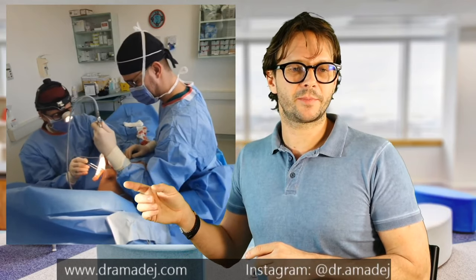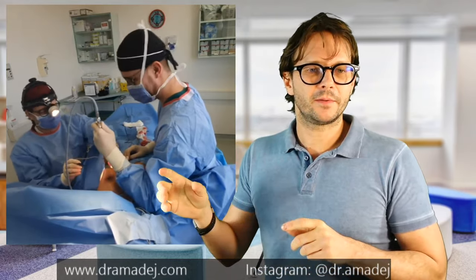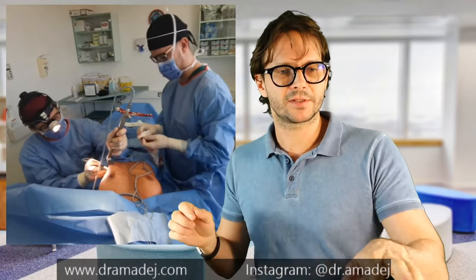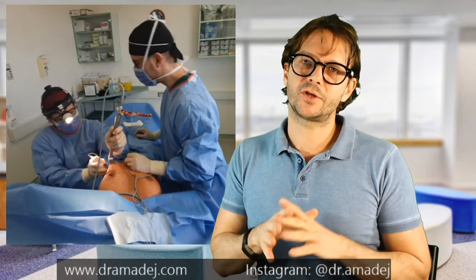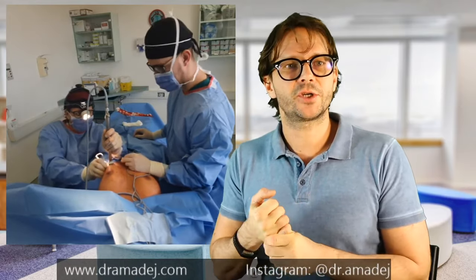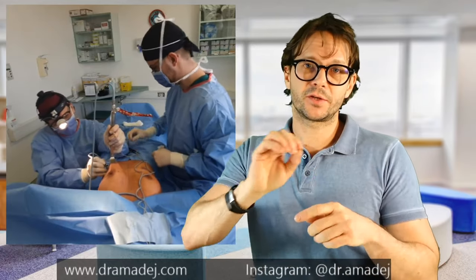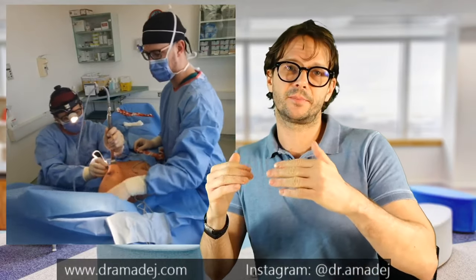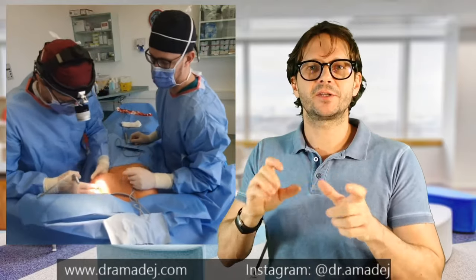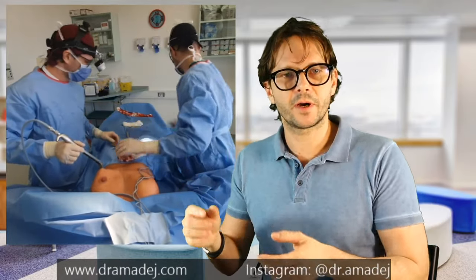A little bit of coagulation to stop the bleeding and this site is almost ready for an implant. Let me explain what happens before entering the operating room. When a patient comes to our clinic, she is welcomed into the room where she talks to the surgeon one more time to go through the plan, and the surgeon does the markings. At this time there's also a chance for some final adjustments — many patients ask to go a little bit bigger or smaller than discussed, which is usually not a problem.